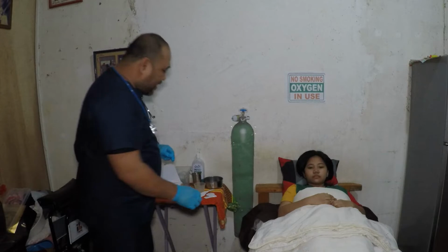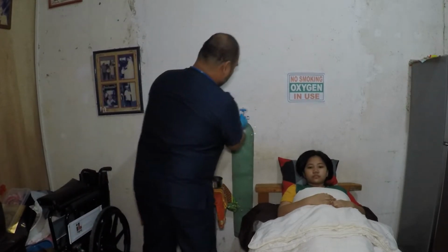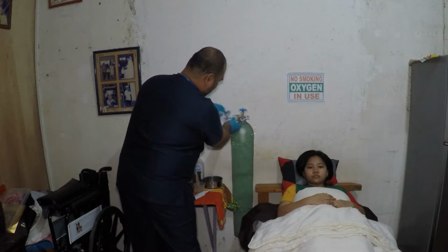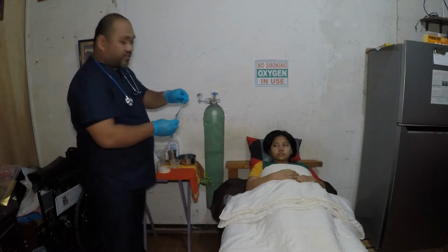Then we have to assemble the equipment to facilitate skill and accuracy in performance. We have also to prepare the oxygen equipment. First, this is what we're going to do. Attach the flow meter. Fill the humidifier one-third with sterile water or boiled water.